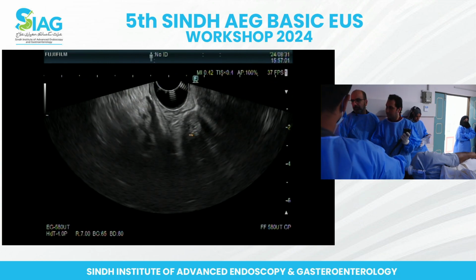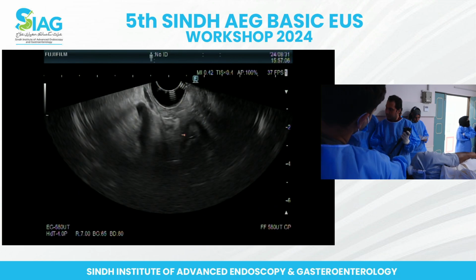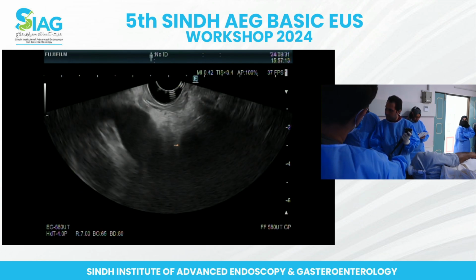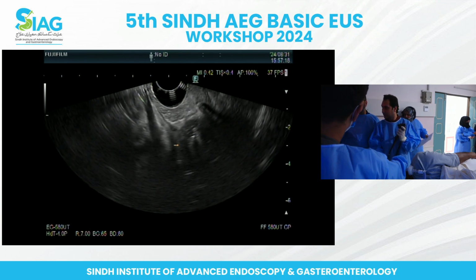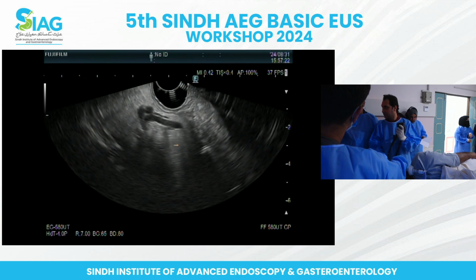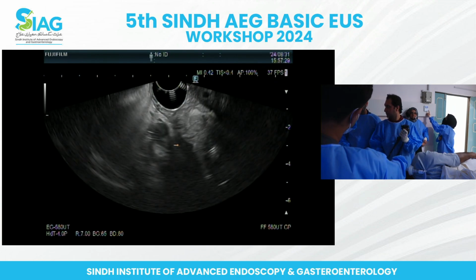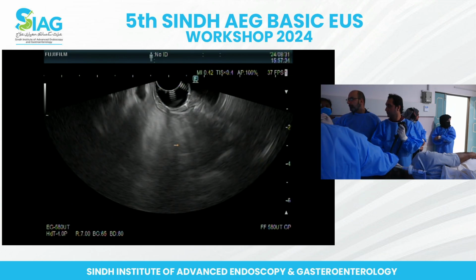There's your bile duct again. Keep going counter. Big wheel towards you. Keep going counter. And big wheel towards you. Bring it close to you. Big wheel towards you. Push forward. So yeah, this is a constant back and forth between you and the duodenal wall to see how you can maintain that stent. So there's a lot of small movements in the bulb area, okay? But again, for interest of time, we're going to go now to the second portion. But that's how you basically find your lesion and then keep a view endoscopically.